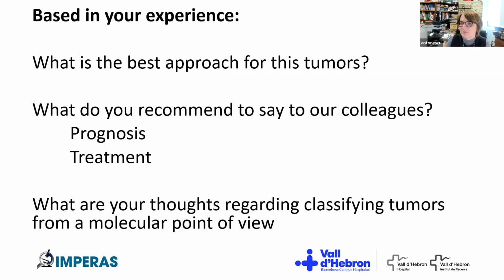I think molecular pathologists just made us better pathologists, right? More objective criteria. I mean, before molecular, how would you have called this? Probably desmoplastic round cell tumor, right? It's still a sarcoma, but it's good to know, right? Knowledge is very important. It's the first step of treating better, managing better.